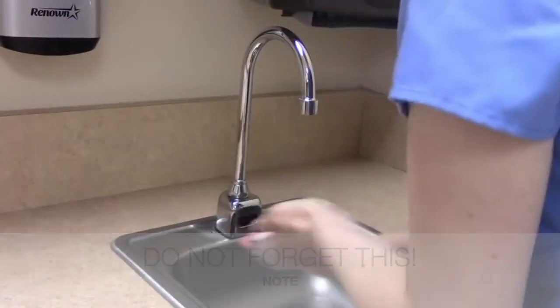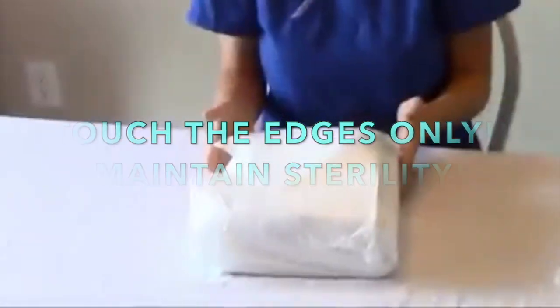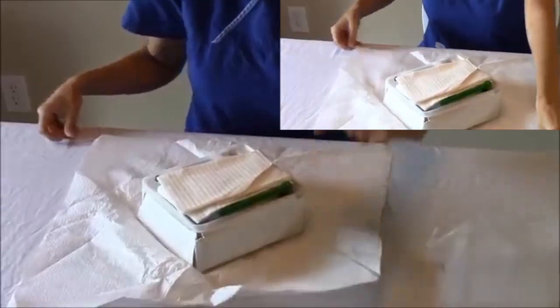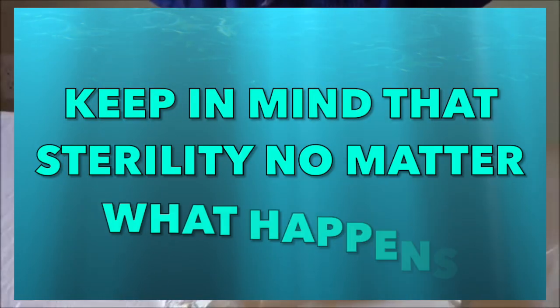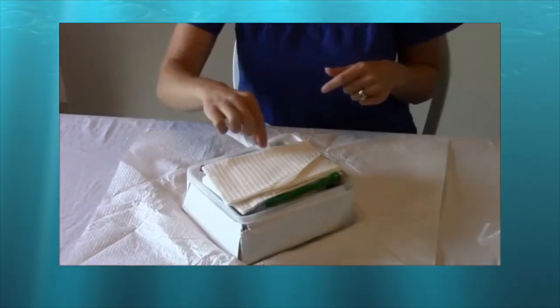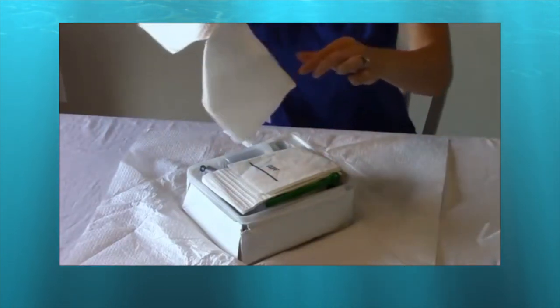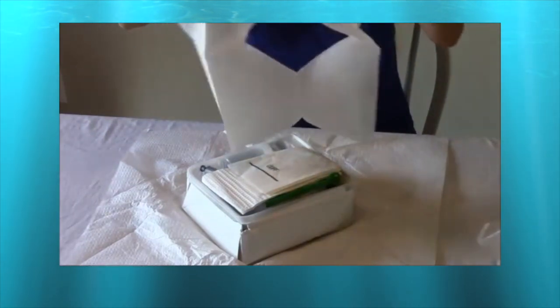Once everything is set up, do hand washing. I already have the set here, already removed from the package. Always remember to touch the edge only of this packaging since we are maintaining sterility. On top of the packaging is the drape, which we are going to use to cover the vaginal or penile area of the patient.